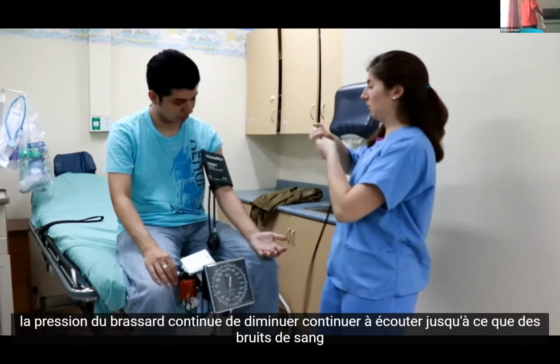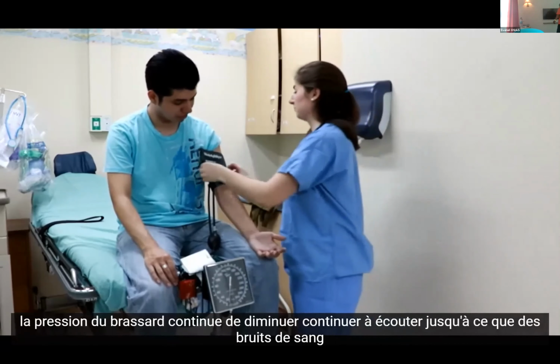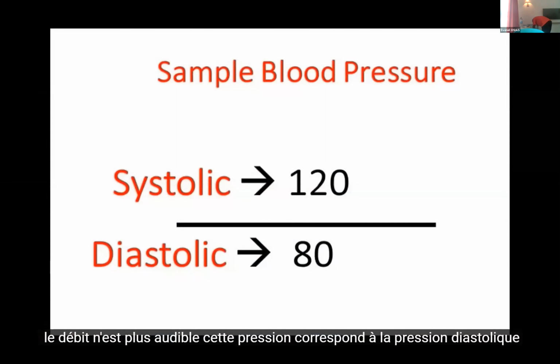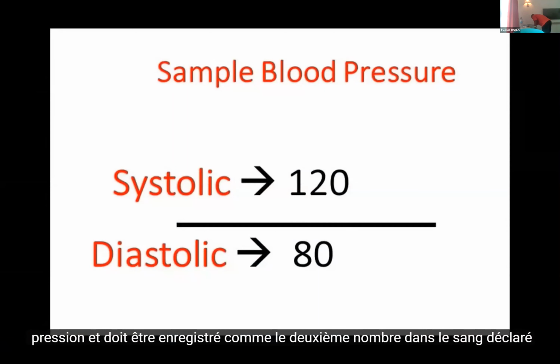As the cuff pressure continues to decrease, continue to listen until sounds of blood flow can no longer be heard. This pressure corresponds to the diastolic pressure and should be recorded as the second number in the reported blood pressure.